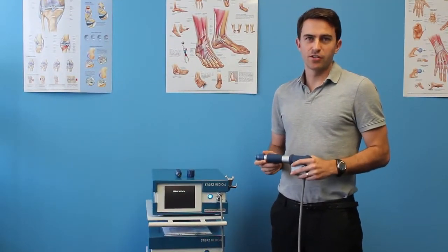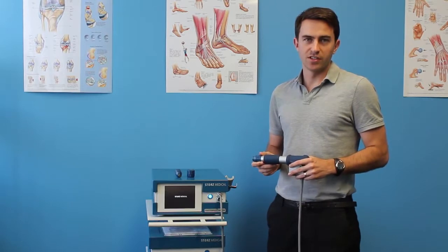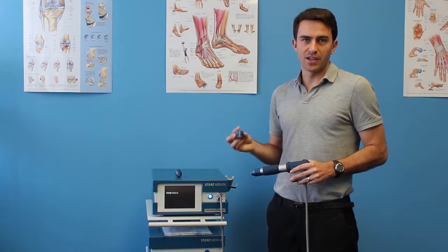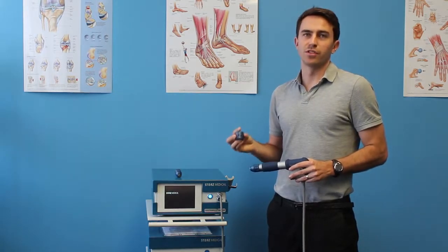Depending on the size of the area to be treated and how acute your condition is, we have three different heads available to us. These different heads allow us to treat at different depths and more effectively treat your condition.